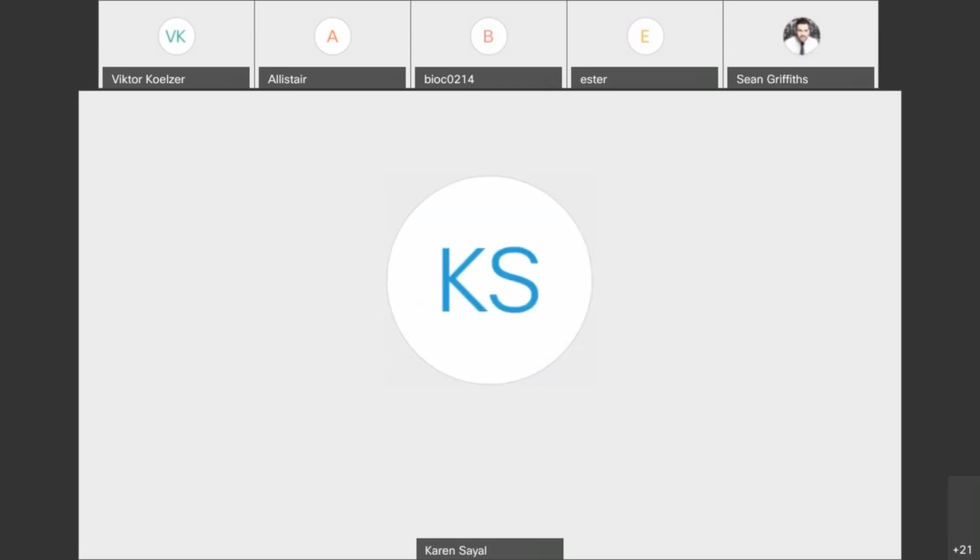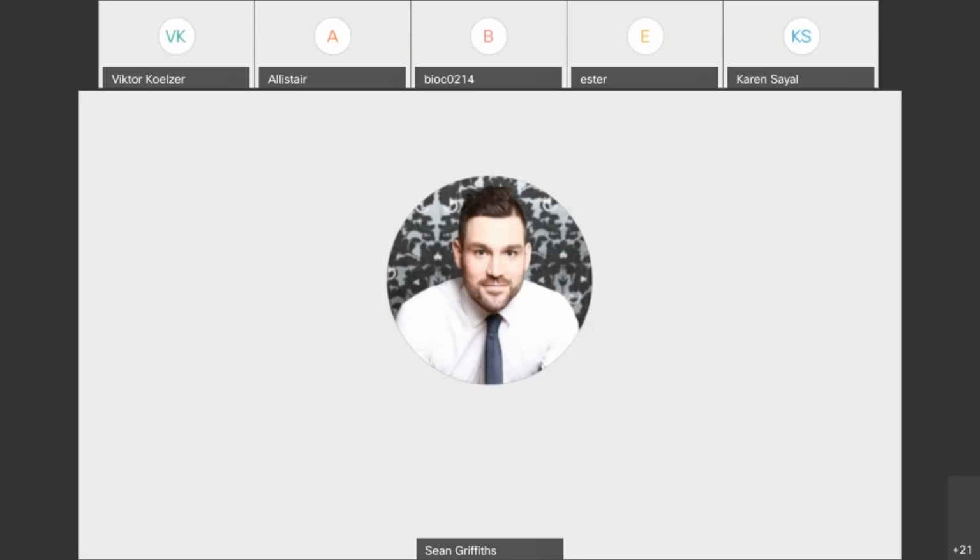Okay, so I guess we're almost at the end of the two-hour mark. So we'll probably have to pause there for today. The outlying agenda items are really the analysis using algorithms, such as the multiplex fluorescence, and also we've got the RNA scope. We've probably dealt with the bulk of the difficult topics today, particularly the AI. It's one of your most powerful tools, but it's also one of the hardest ones to get to grips with.